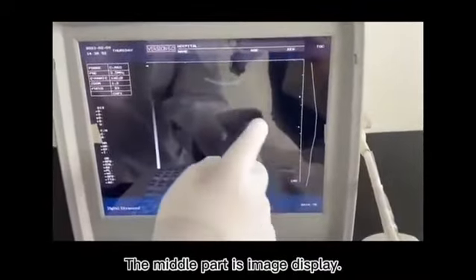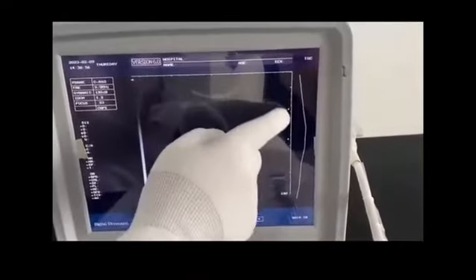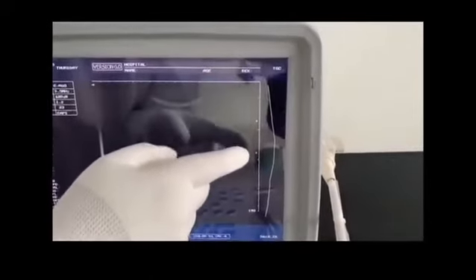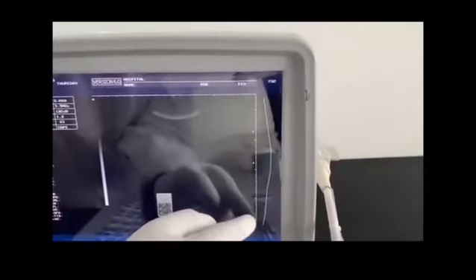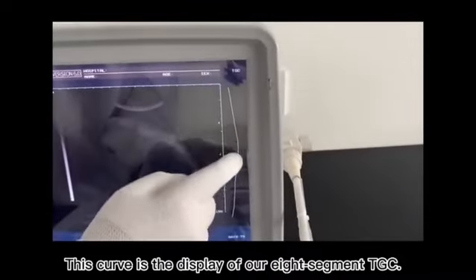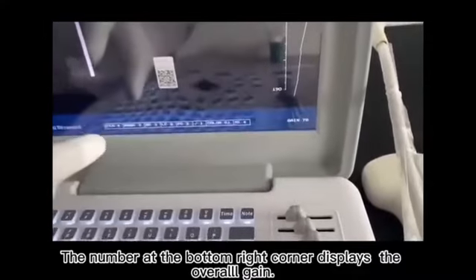The middle part is image display. The right part is focus display area. Beside focus, there is a scale of image depth. This curve is the display of our 8-segment TGC. The number at the bottom right corner displays the overall gain.